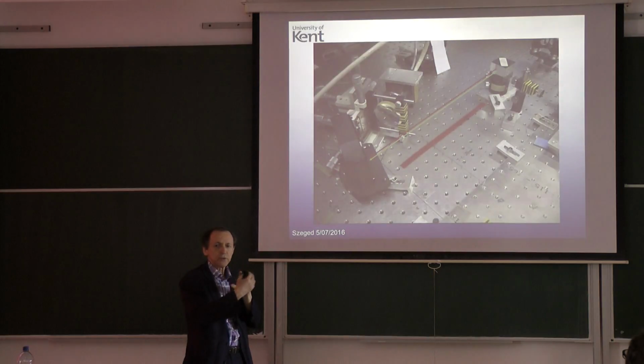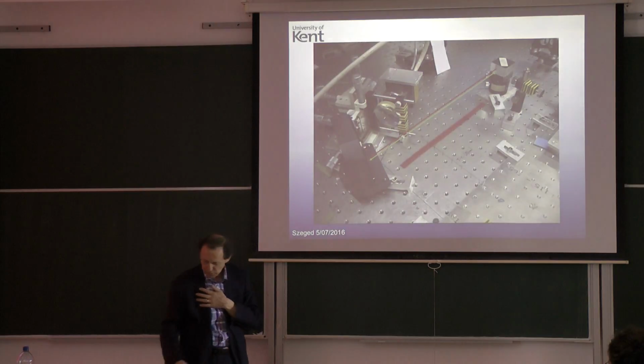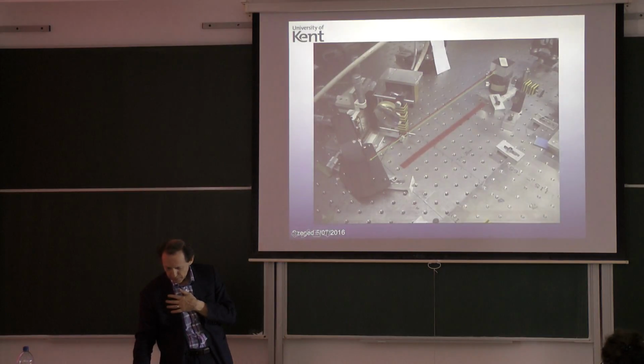So that means that in between the two halves of the beam, I will have one through the air going quicker than the other one through the glass being delayed. So it's like I will improvise a two-beam interferometer. And look here what happens.